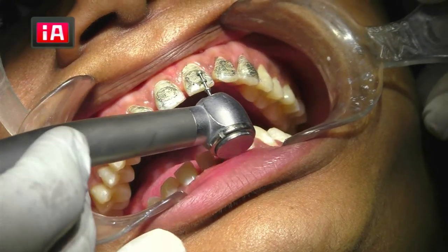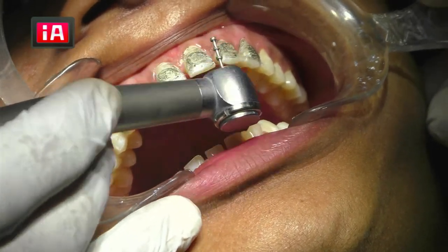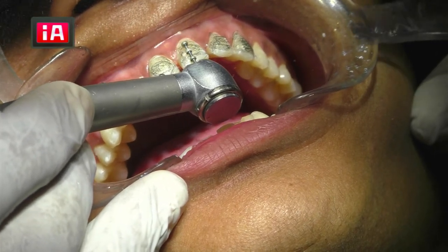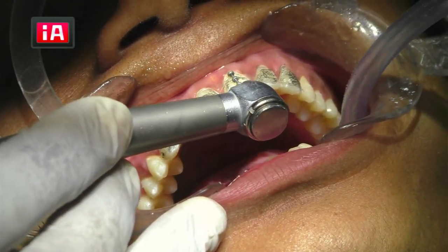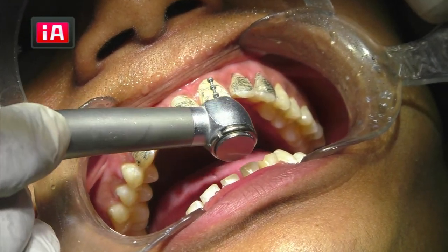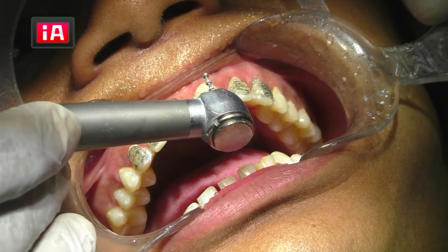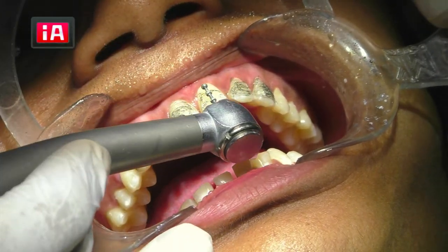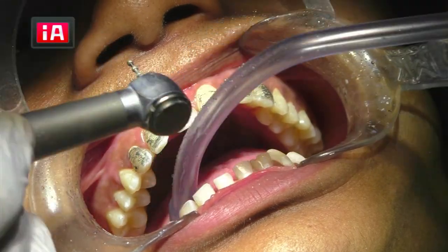I'll just show. One plane, and a second plane. You can see this? The graphite marking has gone, like this and like this. Now I have to join these grooves. Don't make them very deep, otherwise tooth structure will be lost while correcting. The depth cutting grooves should not be very, very deep; it has to be a little less. One, two. Now I'll do the depth cutting on all the teeth.